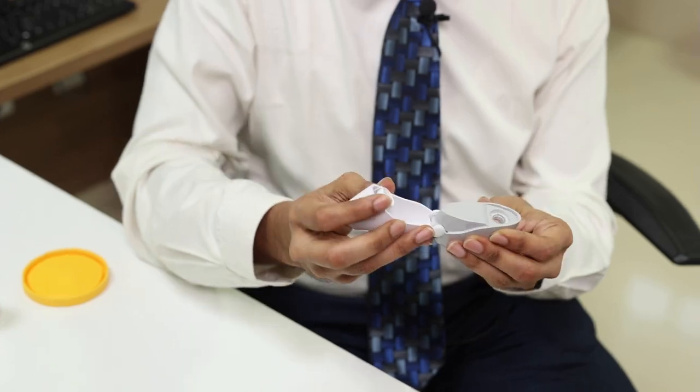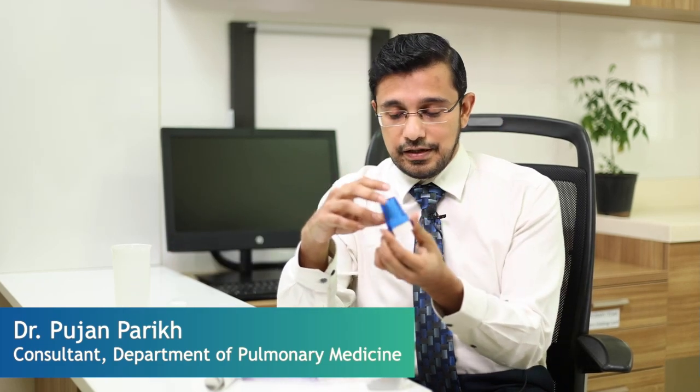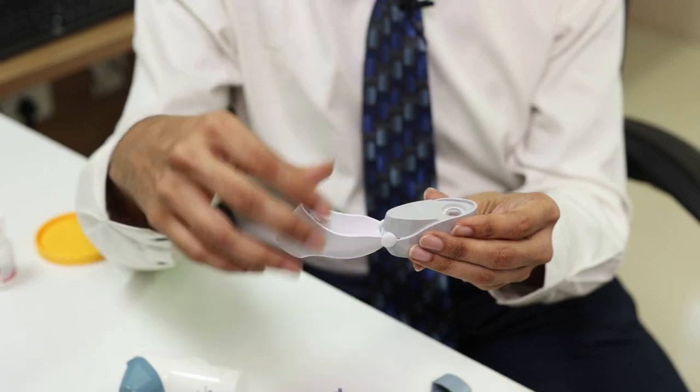There are various devices which can be used as a DPI. DPI is basically a dry powder inhaler. So this is the Revolizer and this is the other, the Lupihaler device. Now we have to take a capsule which contains a powder and put it in this device and close it.